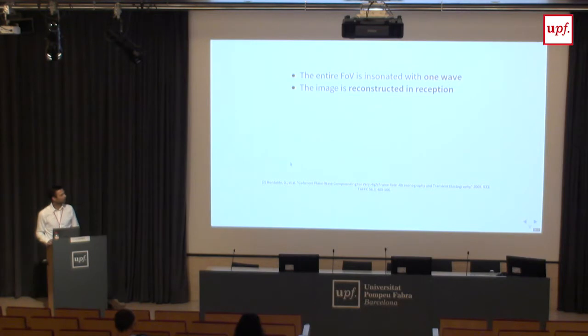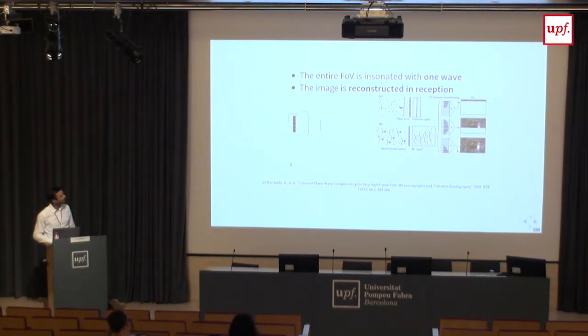So how does ultrafast ultrasound work? Well, actually, surprisingly, or perhaps not, it is simpler in concept than standard ultrasound. Basically, the way it works is instead of focusing our wave, we actually excite, well, this is one way this can work. The main idea behind it is that instead of sending a wave that is focused in one direction, you send a wave that will insonify the whole space. So all the things that you want to look at will be swept or invaded by the sound wave, and then you will receive data from everywhere at once.